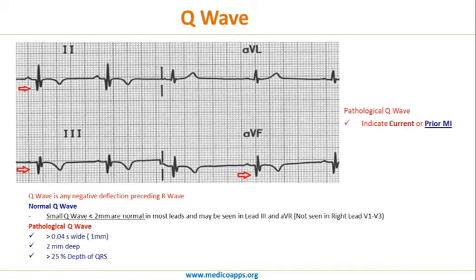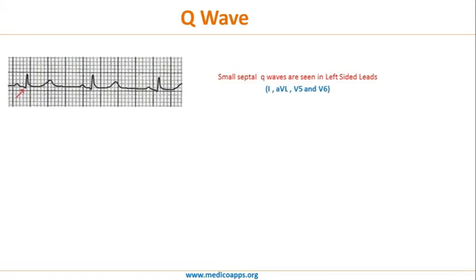Pathological Q waves are seen in current or prior myocardial infarction. In many cases of prior MI, you can find pathological Q waves. In this ECG, you can see small septal Q waves as seen in left-sided leads. These Q waves are small — not more than 2 mm deep or more than one small square in width — so they are normal Q waves.